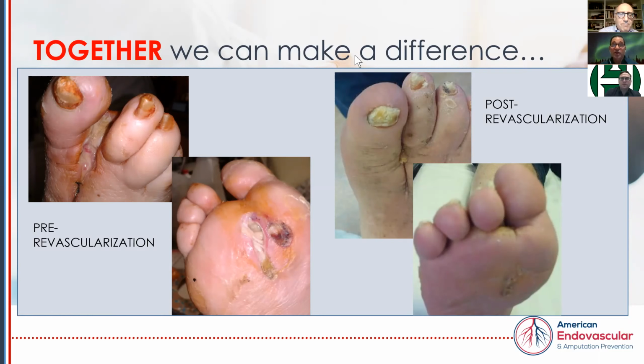Fabulous. And just to answer your question, how often do we go up and over from the contralateral groin versus antegrade? We go antegrade whenever possible. And at this point, almost 40% of our patients, if not more, will get a pedal access as well. This really keeps our options open for intraluminal recanalization and through-and-through access, to make sure that we reconstitute the vessel at the point where collaterals are naturally reconstituting it and don't extend dissections. And really, that's why we need that pre-intervention information, to make sure that the common femoral artery and proximal portion of the SFA are open and to have a sense of what the tibial targets are for puncture, although we may see that from angiography.